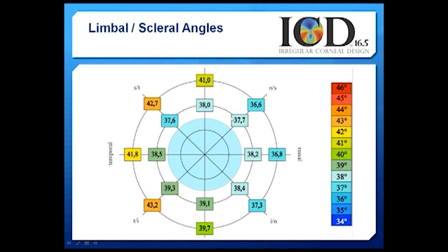In this inner ring, the 15 millimeter chord or 15 millimeter diameter, the eye has about 1.7 degrees of differential around the clock. At the 20 millimeter chord, the eye shows 6.6 degrees of differential around the clock.